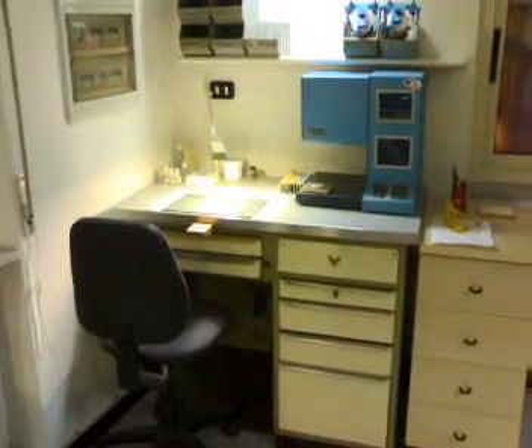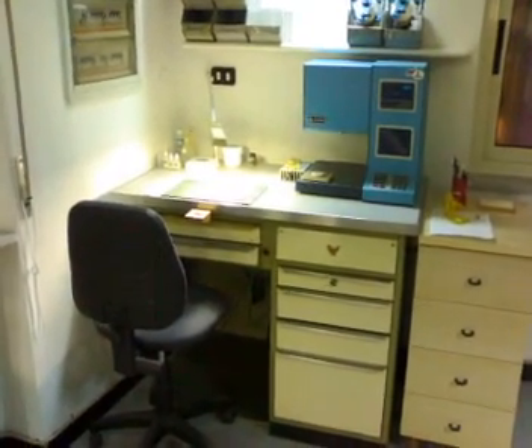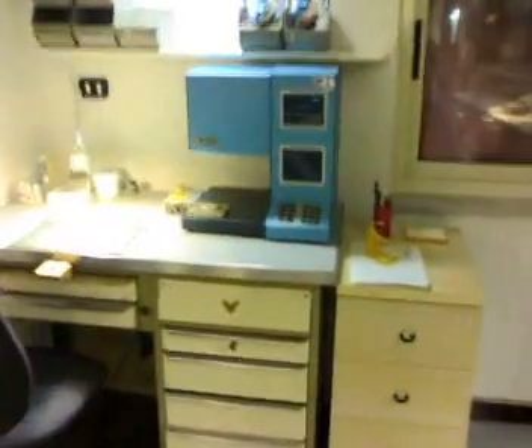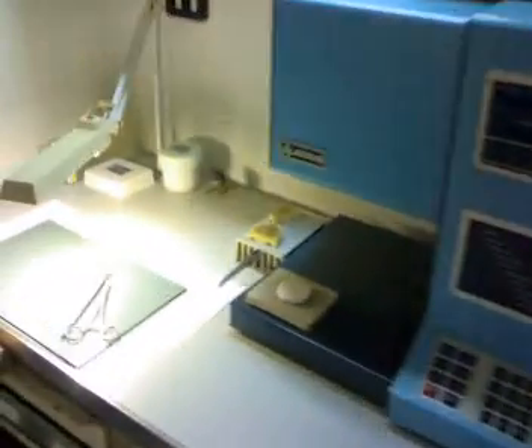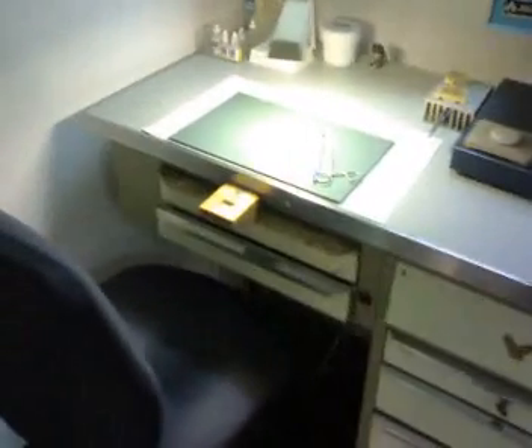This position here is where I do the metal conditioning, on this oven right here. Besides metal conditioning, I also apply the opaque in this area. No ceramic or porcelain work is done here — just opaque application and metal conditioning.